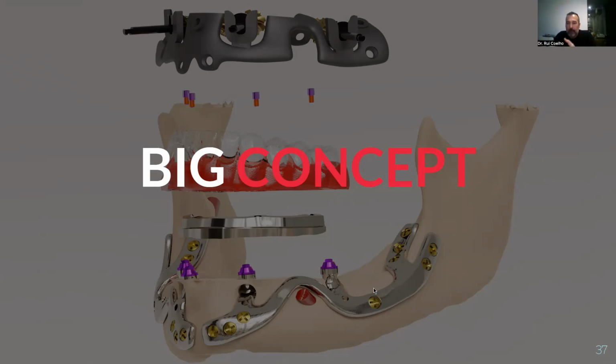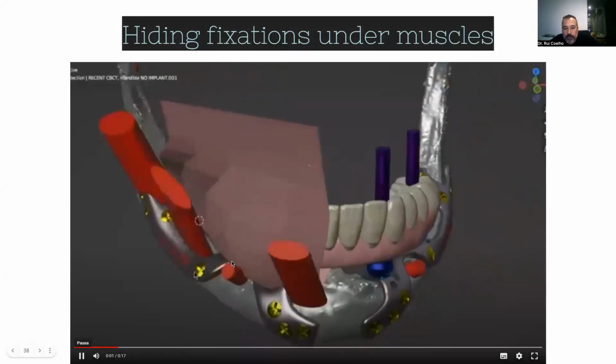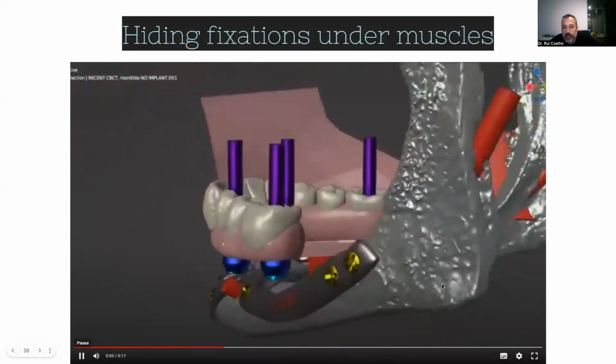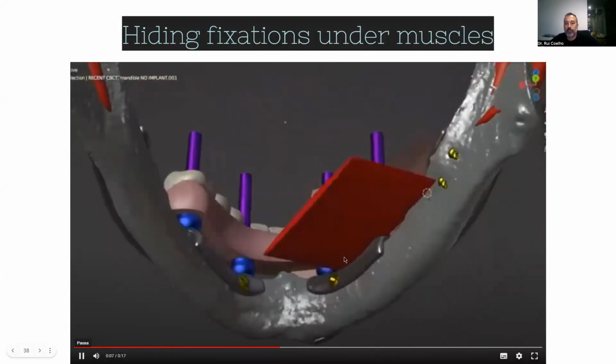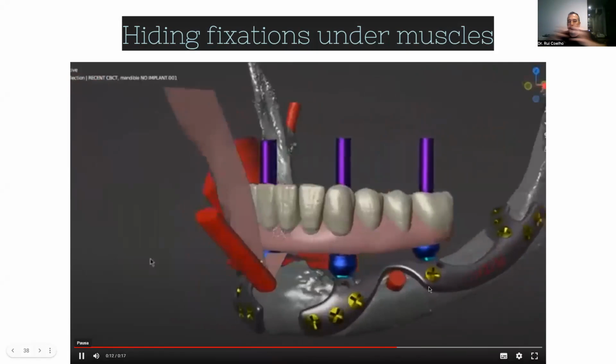We accept that you are going to have inflammation. It's impossible not to have inflammation if you have mobility of the tissue. What I want is not to compromise my fixations. And that's what I'm going to try to show you here. You can see mentalis, buccinator, masseter, mylohyoid. And what I try to do is to force all these muscles to go above the plates.